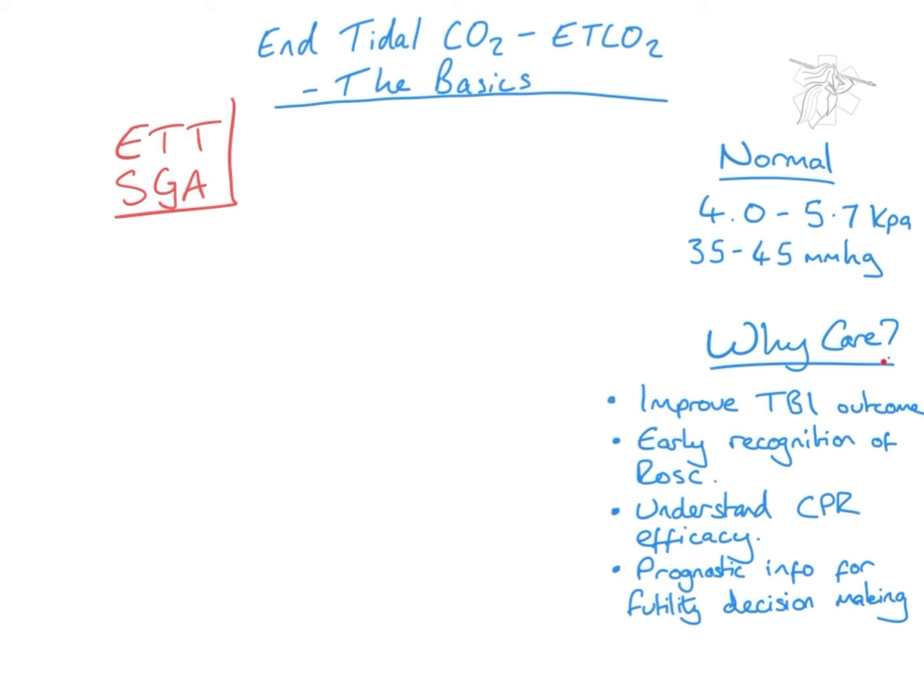But why do we actually care about end-tidal CO2 monitoring? There's lots and lots of reasons why, but some of the ones relevant to pre-hospital emergency practice, so for paramedics and pre-hospital doctors, is first of all we know that if we manage it well, if we maintain these normal ranges, we actually improve the outcomes of patients suffering with a traumatic brain injury. We know that in cardiac arrest, it gives us one of the earliest indications that we've got return of spontaneous circulation, so ROSC, so our patient has responded to our resuscitation and we've got them back. It also allows us to understand whether our CPR is effective or not.